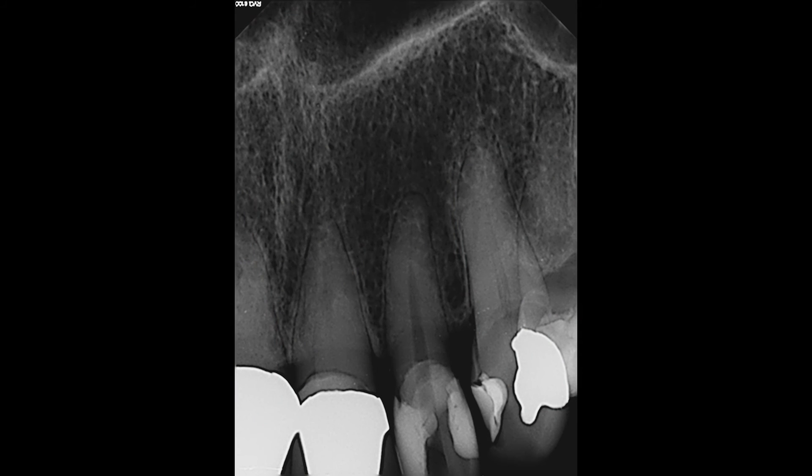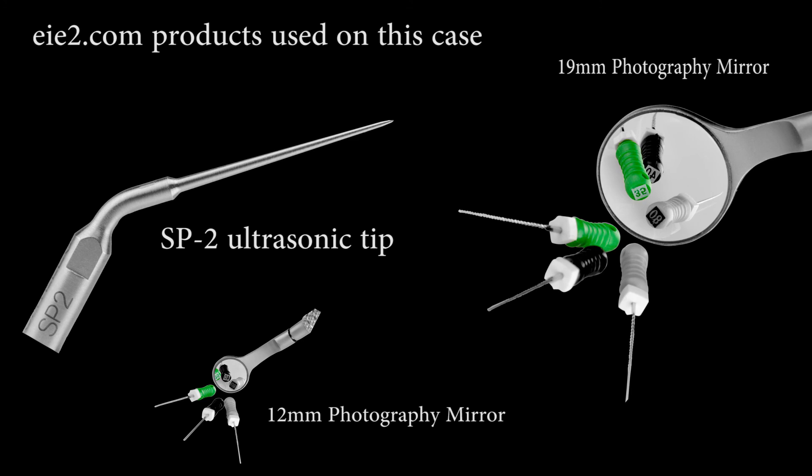Here you can see the canal has not been hollowed out unnecessarily and the instrument is removed. The products we used on this case were the SP2 ultrasonic tip and the 19 and 12 millimeter photographic mirrors.